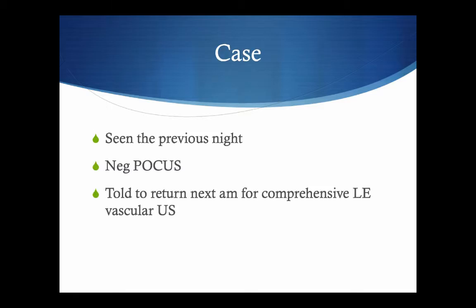So just a little bit more about her. She was seen the previous night. She had a negative point-of-care ultrasound for DVT, but told to come back the next morning. You've got to come back tomorrow to get the word I hate, formal, let's say comprehensive or consultative ultrasound study.